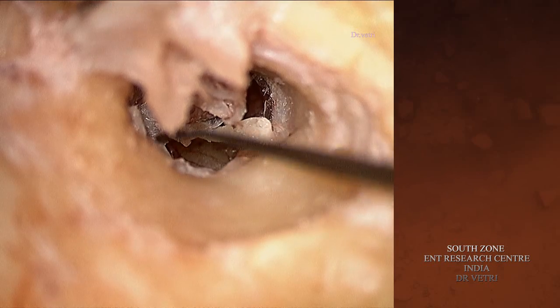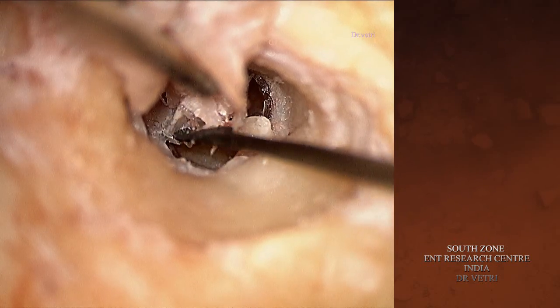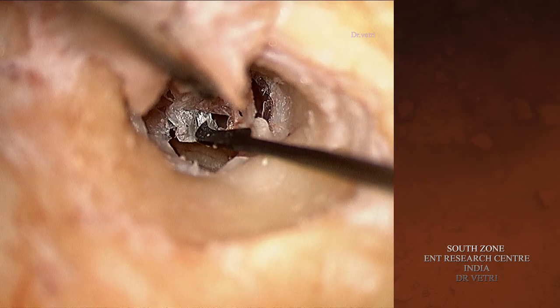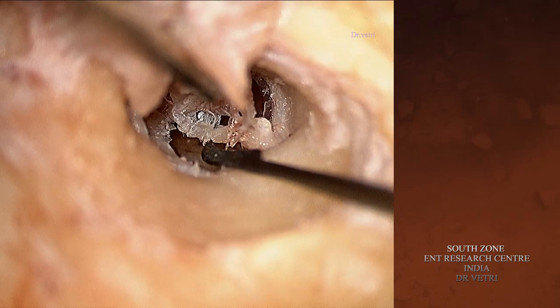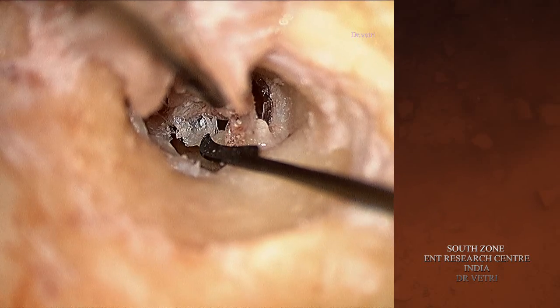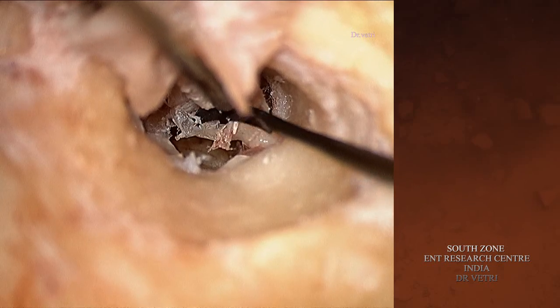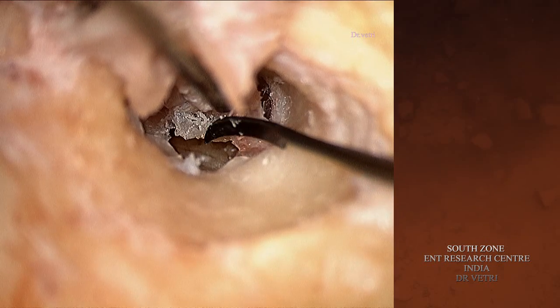The tympanic membrane attached to the malleus handle is now being released. The umbo is the toughest part of the attachment of the tympanic membrane to the handle of malleus by a strong ligament.